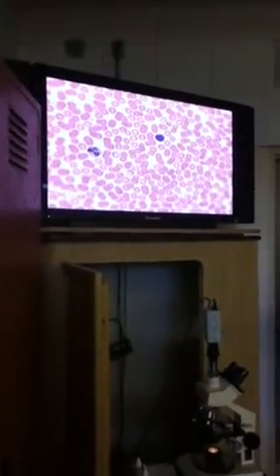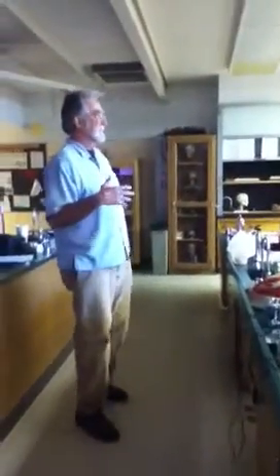The best way to look at these, some of these are granulated, some are agranular, but the key is to look at the nuclear formation or the granulation formation. Because each one of these particular leukocytes has a very specific pattern of the nucleus. Like if you look over here under neutrophils, you'll see that there's at least 3 different land masses, so to speak. So anytime you're looking at a leukocyte and you see 1, 2, 3 different land masses, that's going to be a neutrophil.